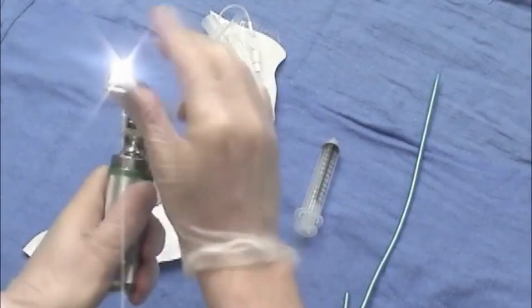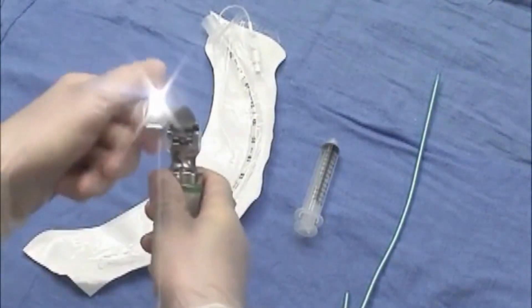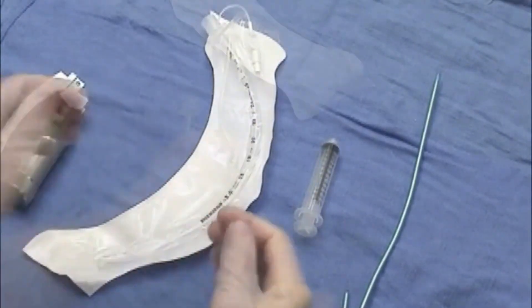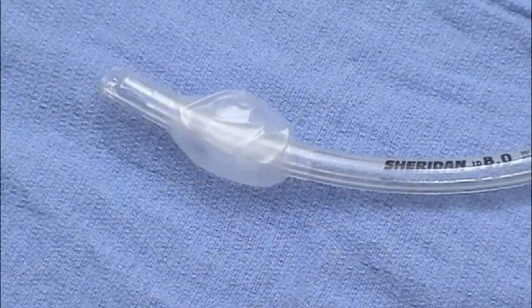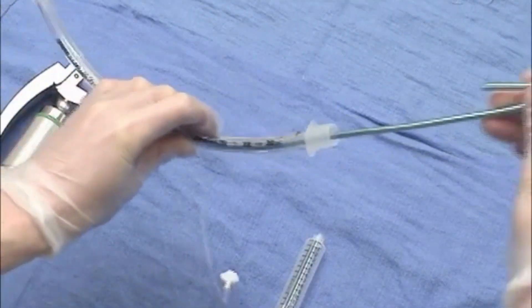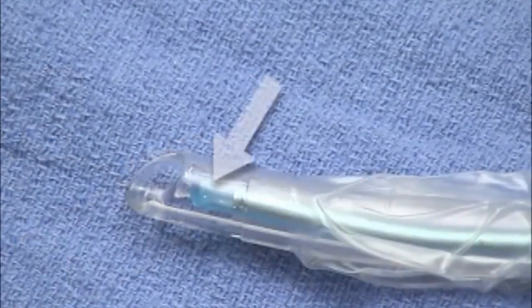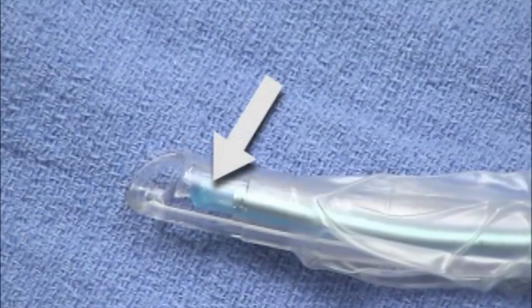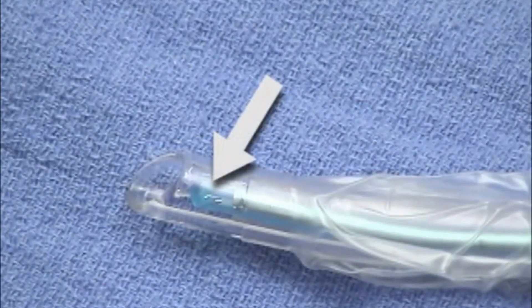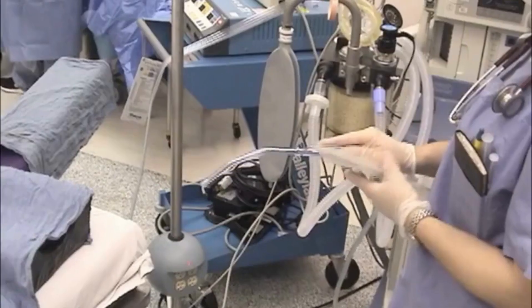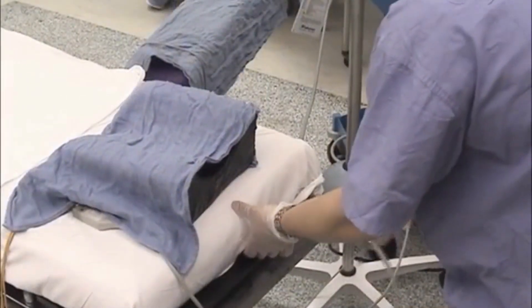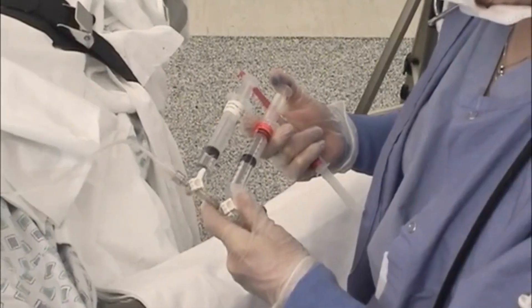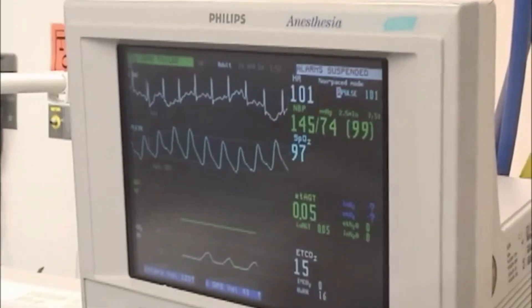Be sure that all equipment is readily accessible and functioning properly. Check the cuff of the endotracheal tube for leaks. Insert the stylet into the endotracheal tube, making sure that the tip of the stylet does not extend beyond the end of the tube. Be sure that the suction catheter is secured within easy reach. Obtain intravenous access and place the patient on a monitor.